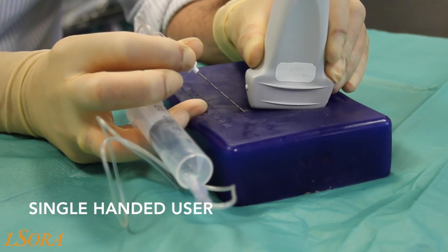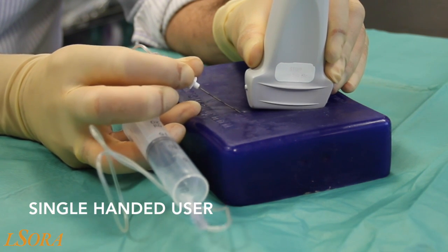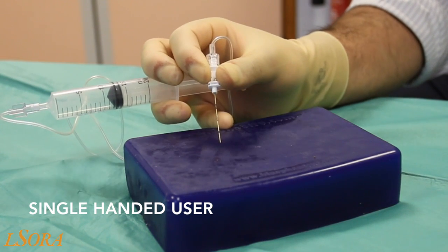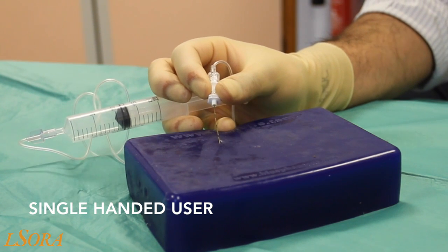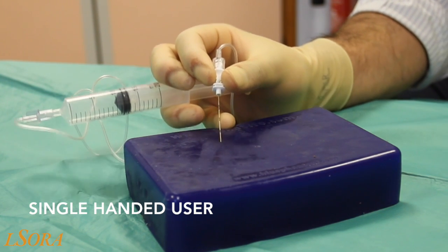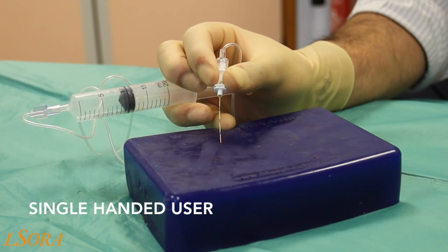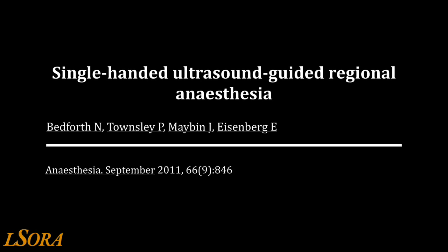The single-handed user grip is now demonstrated on a phantom. The needle is inserted in the normal manner with the probe in situ. The probe has been removed for clarity. The needle can be manipulated in the normal manner, and injection is continued by pressure from the thenar eminence onto the plunger of the syringe. Again, the ability to aspirate is not possible with this technique. A reference to the single-handed user technique is shown here.